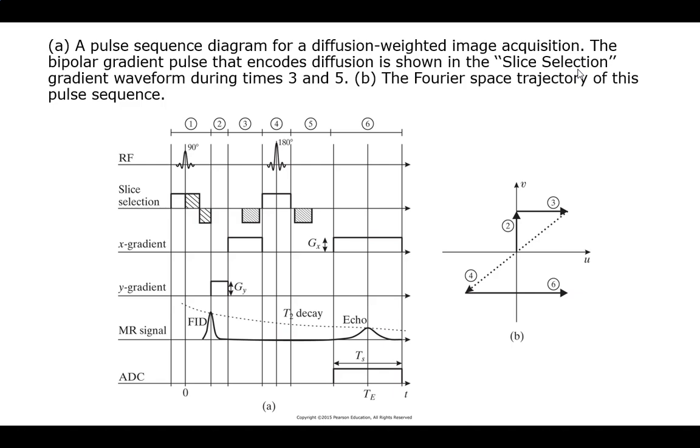So what benefit does being careful give us? If I'm measuring something, not all signals are equally strong. Remember, T2 star is, relatively speaking, a stronger signal than T2. Not because T2 is any worse, but because I basically have to use an echo for it, because T2 star is what you'll naturally measure out. You can't measure T2 without the echo. Since it's not directly measurable, it happens so much later that the signal has had more time to decay. That means your signal to noise ratio is smaller.